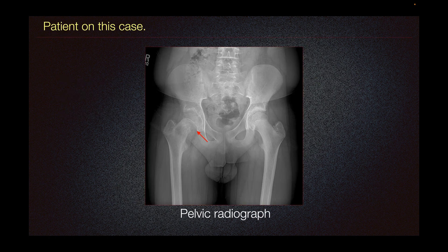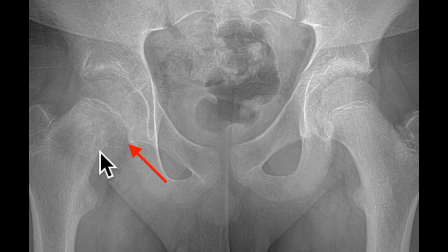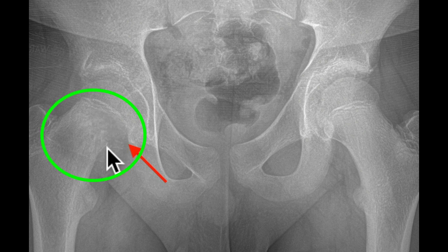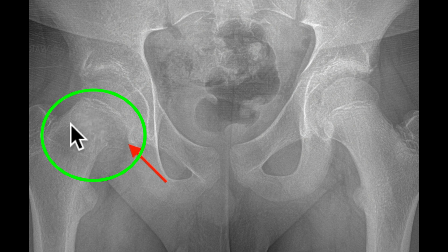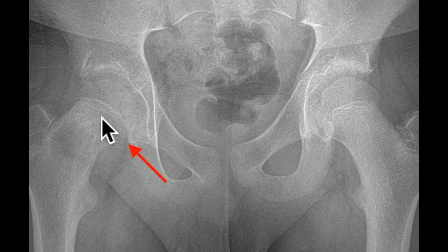The patient in this case presented with this pelvic radiograph, demonstrating an ill-defined region of lucency in the right medial femoral neck with some cortical destruction along its medial margin. There is also an associated wide zone of transition. All these findings are suspicious for an aggressive lesion.